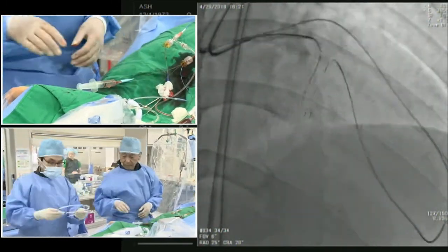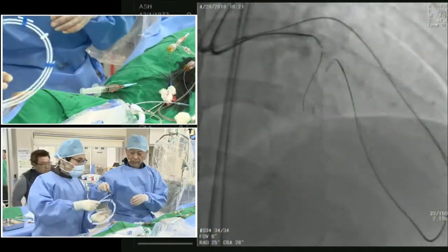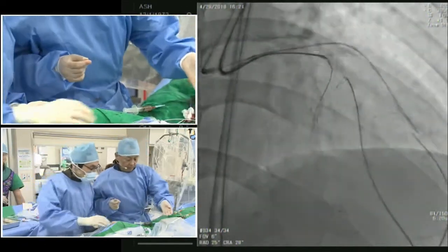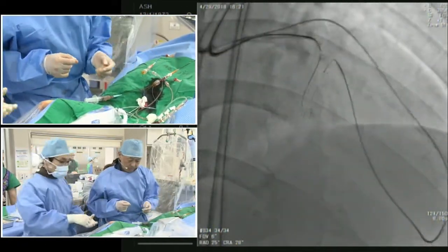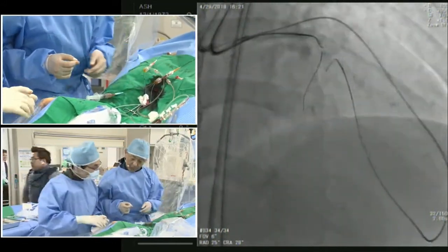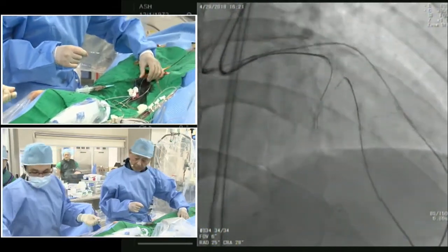Asakura sensei, do you also choose the Gaia 2 in this kind of situation? Yes, Gaia Second, this is Gaia Second. I don't select UB3. UB3 is a little bit crude to pick up this kind of entry point. Please give me one more Intools. Oh, here it is, sorry.